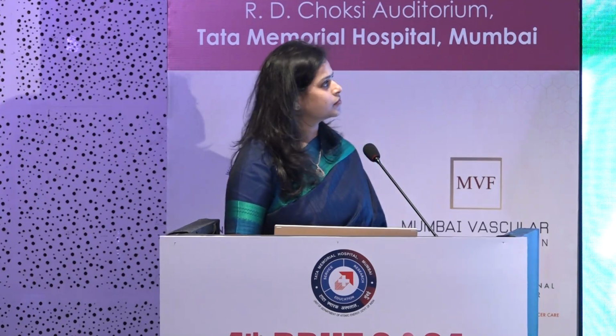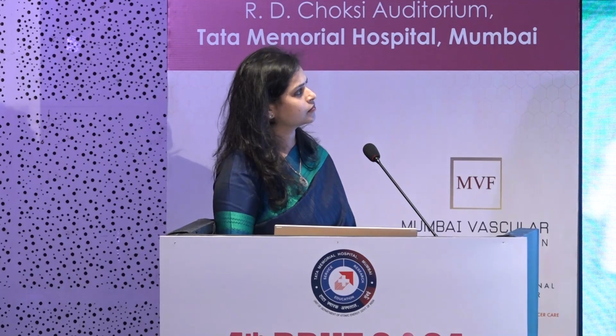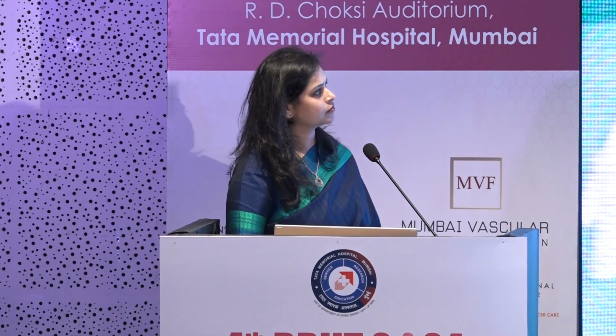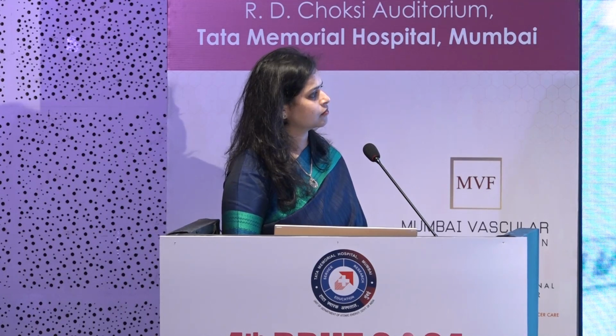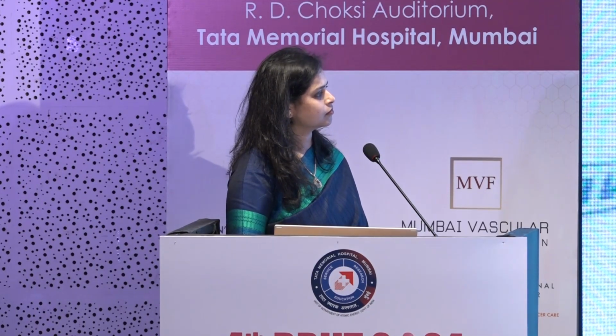Once this is fixed in the position that I want, the trocar will then be pushed inside. We push it in gradually so that the distance is a straight line and it does not deviate in angulation. Once the trocar has gone inside, it is removed carefully.